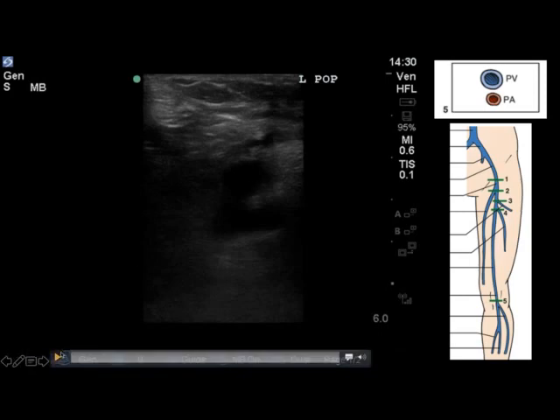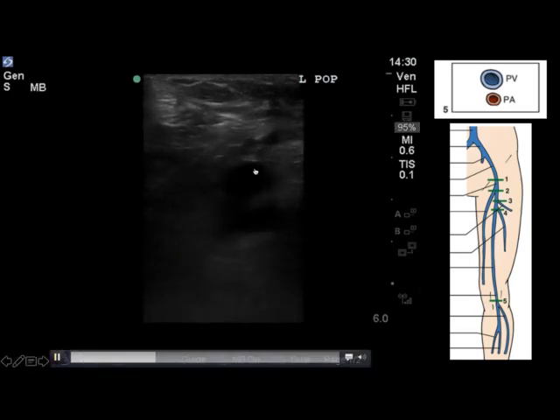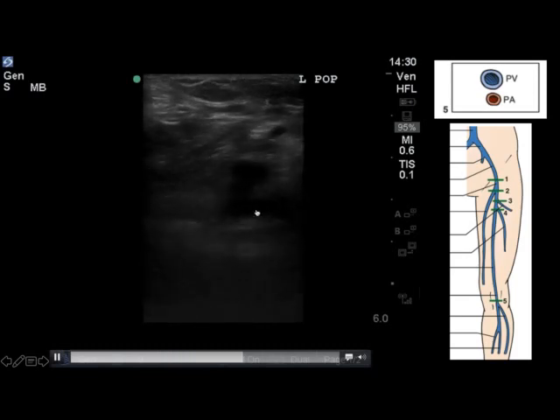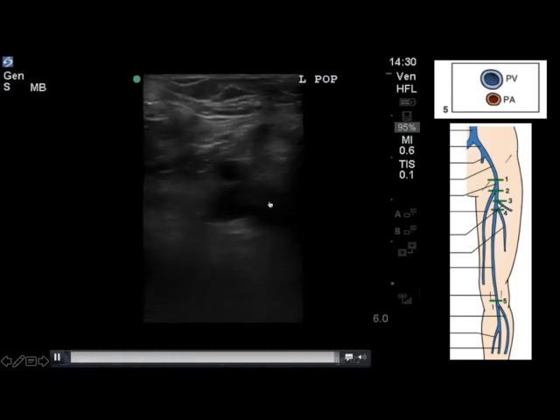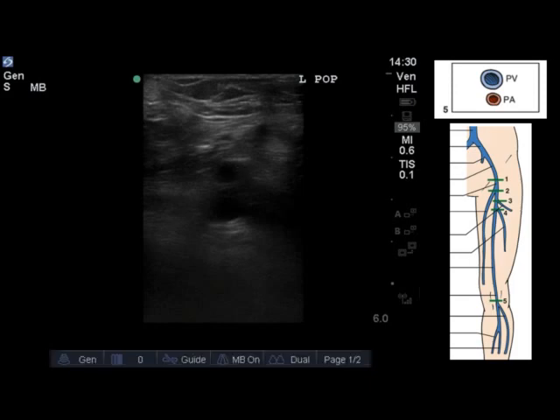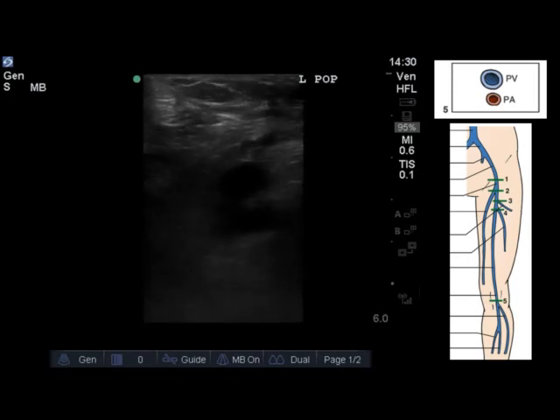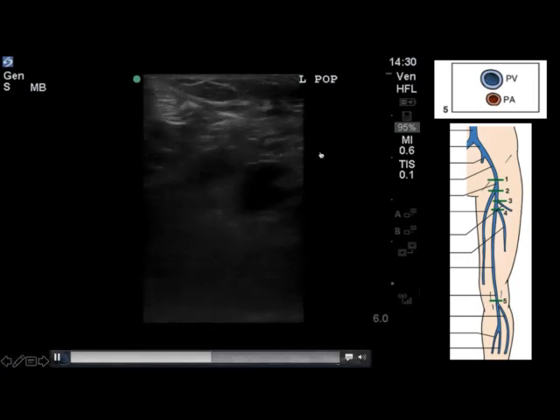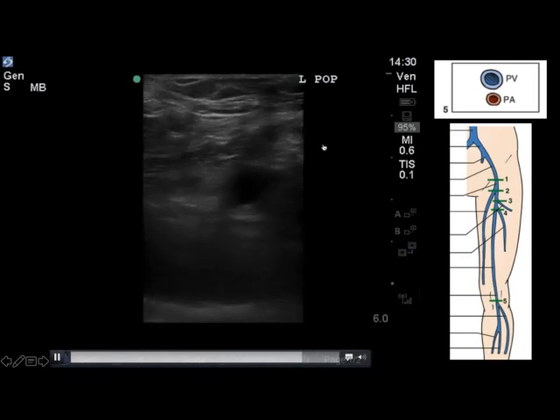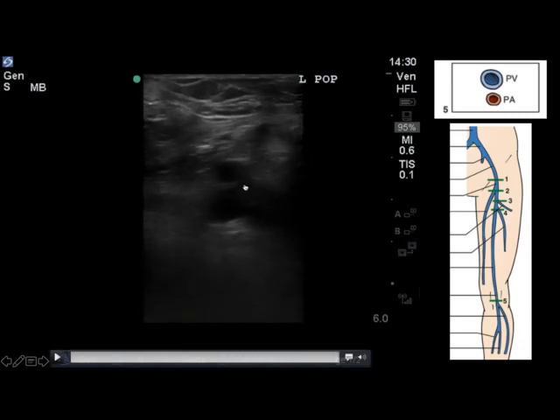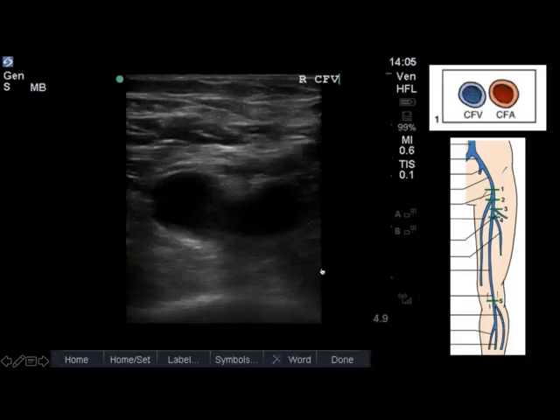Remembering 'pop on top,' you're able to see the popliteal vein on top and the popliteal artery underneath. We're able to fully compress the vein and satisfy ourselves that there is no clot present within this patient's left popliteal fossa. Being careful not to exert too much pressure — you can see it's easy to make out the artery — and making sure that by not putting too much pressure you're not hiding the popliteal vein from yourself.